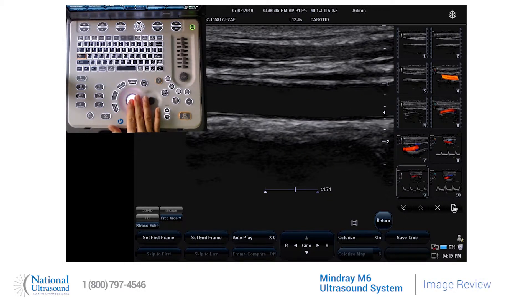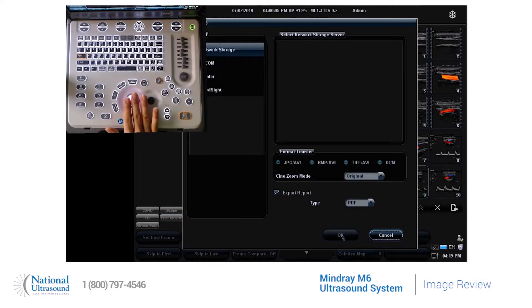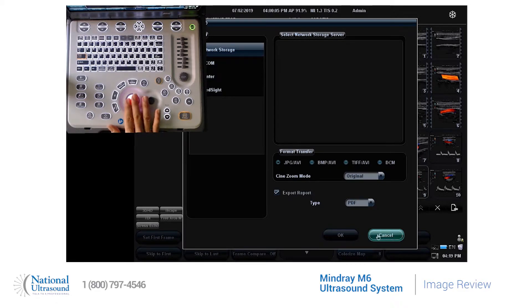By clicking on the Send To button, you will get an option to send the image to a network storage, to a DICOM, or a USB.